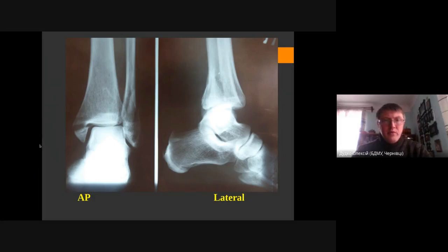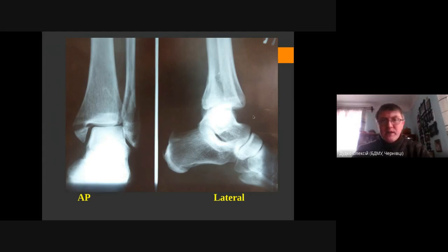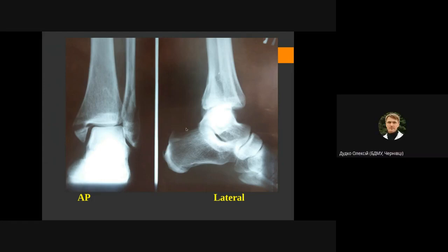This is the AP view. You can estimate the position of the mortise, medial and lateral malleolus. On this view we can see possible dislocations or subluxations of the talus bone. On the lateral view we can see fractures of the posterior malleolus if present, the lateral malleolus, and we can find dislocation of the foot to the posterior or anterior side.